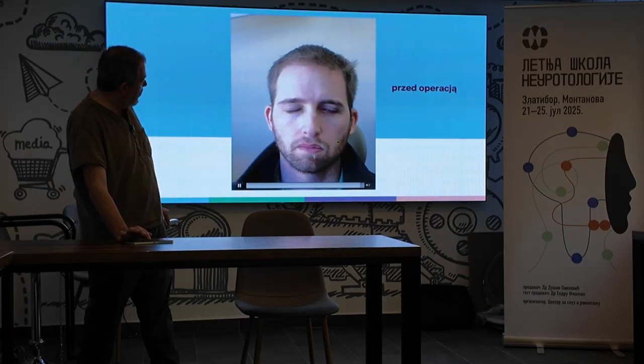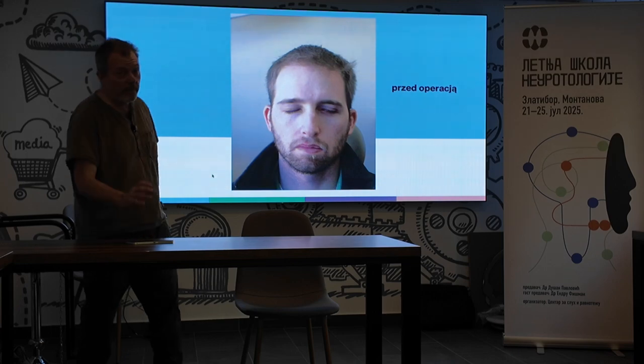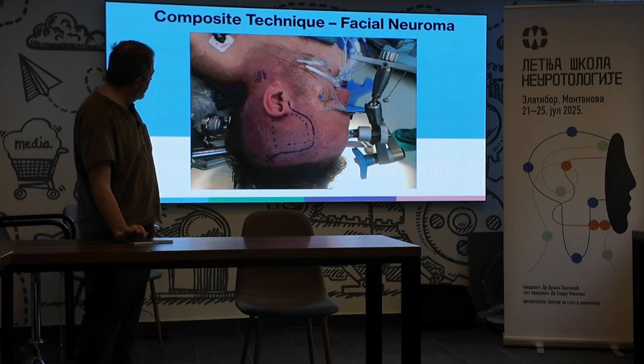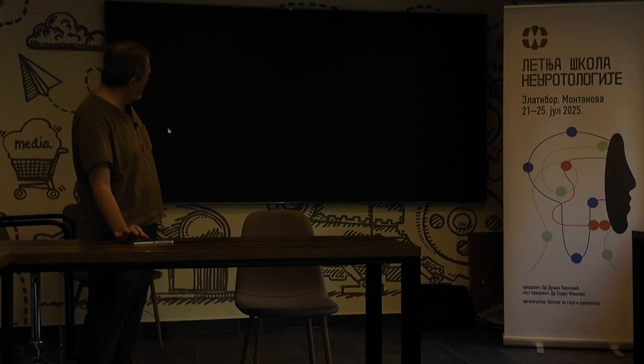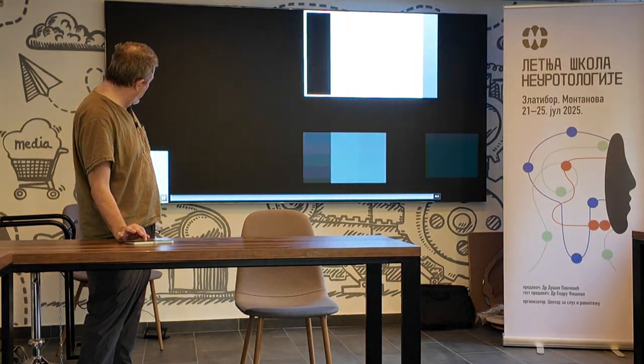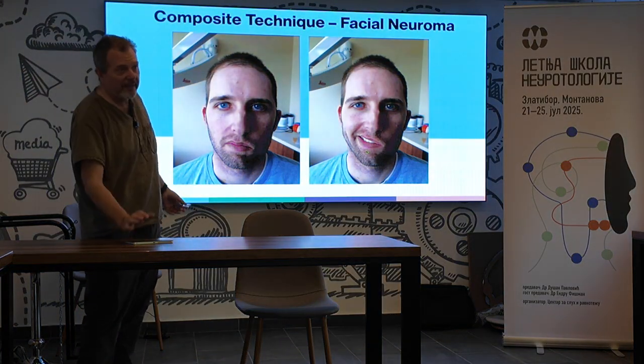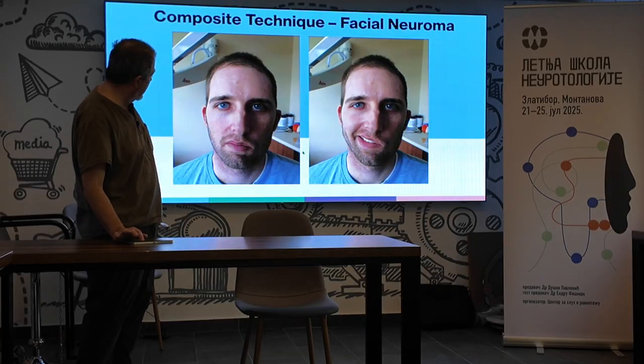And when they have incomplete eye closure is the time you should intervene and do a surgery and take out the facial nerve. Because when you do that, here I did it through a middle cranial fossa, and I'll skip through the film right now just because I've shown enough. Here he is immediately after that surgery. He has now a complete facial nerve paralysis, all right?